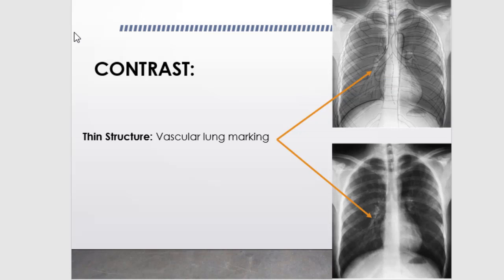If you notice, inside the definition of contrast, there is density. I repeat again: contrast is the difference in density between two adjacent images. Now, you bring the definition of density and replace it inside the definition of contrast. The definition of density is the amount of blackness on the processed image.